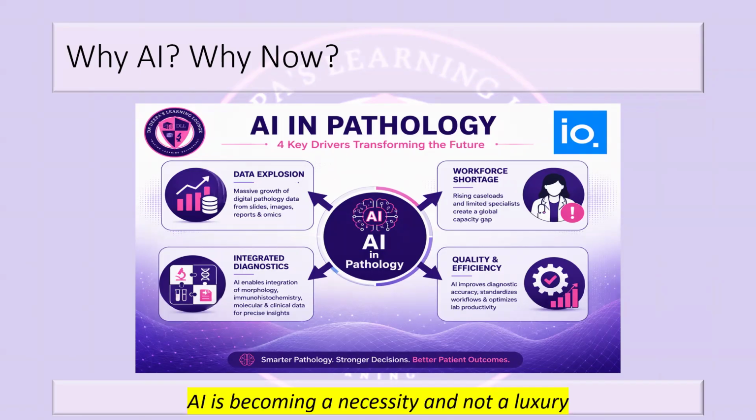AI cannot replace a pathologist, but it can reduce the repetitive tasks and it can prioritize the urgent cases. It can assist in the screening. It can improve the workflow efficiency, and it allows the pathologist to focus on high clinical value and decision making for sure. So that is a very, very important thing that you have to look at. This is the second driver that has caused you to adopt AI.